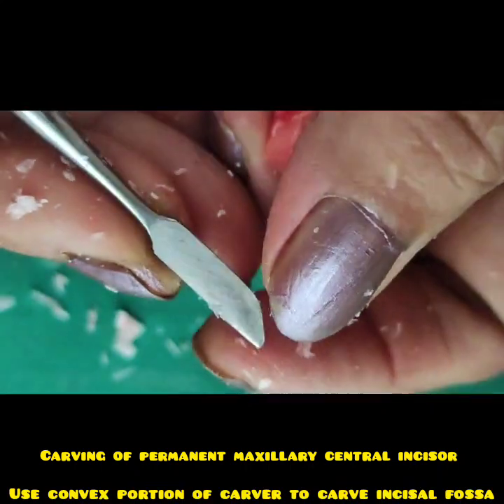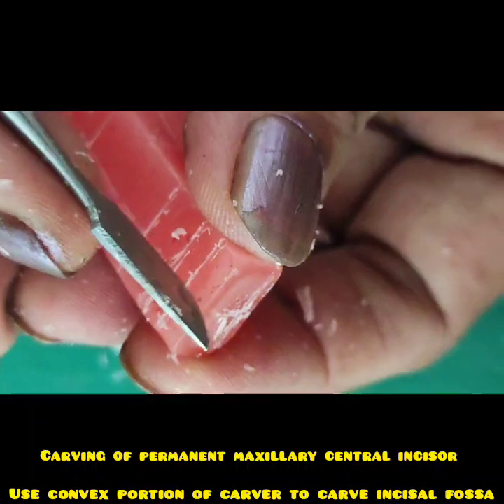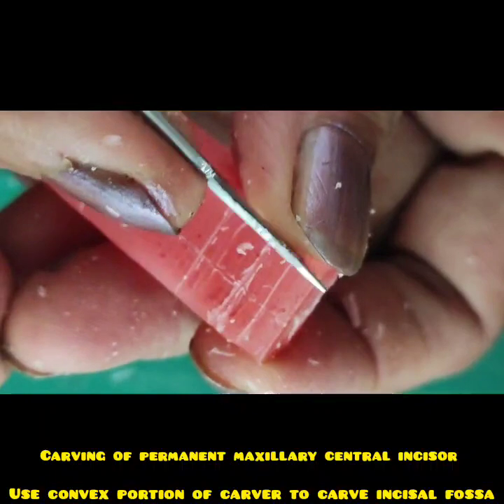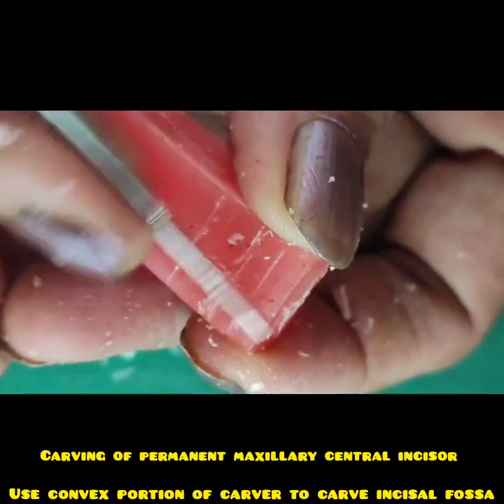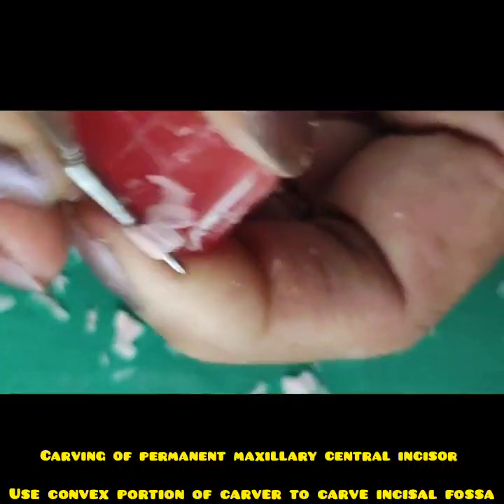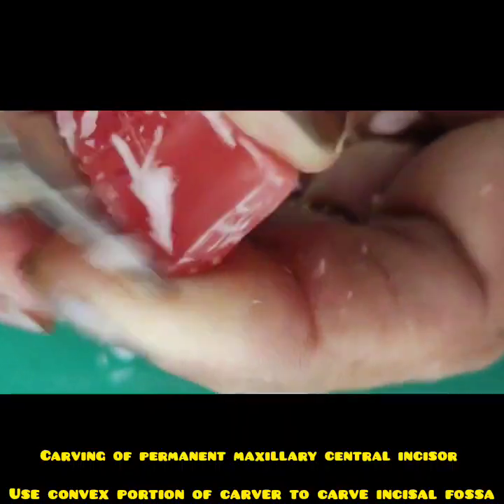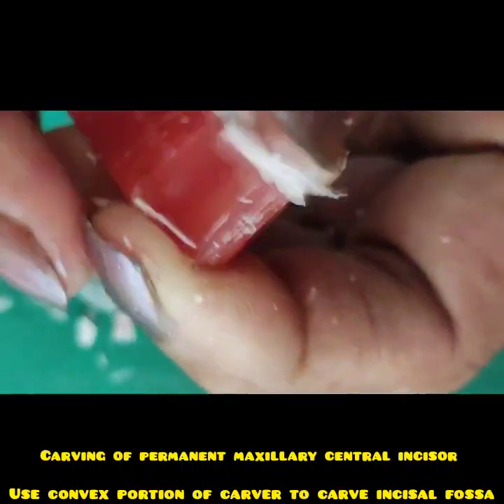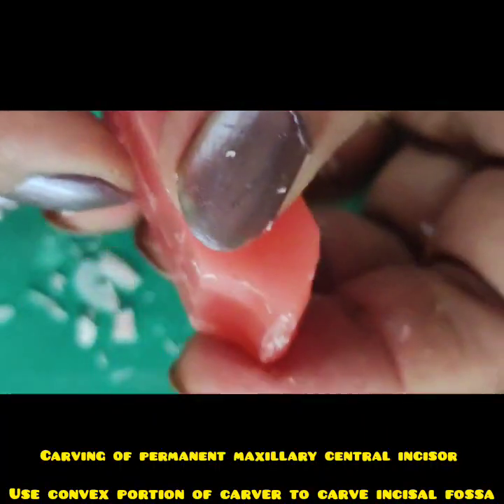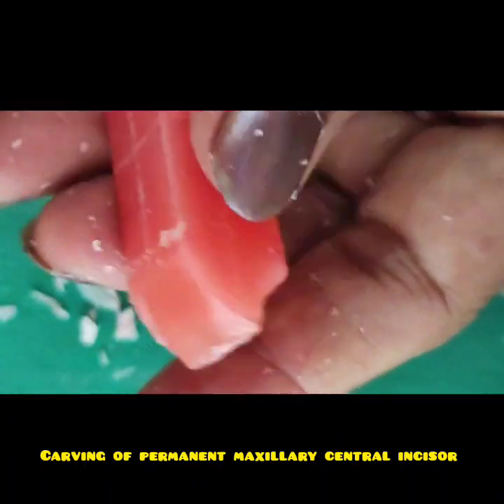Now use the convex portion of the carver to create the concavity of the fossa. This is lower 1/3, upper 2/3. My convexity will touch here, and then from thumb to index finger move horizontally and create a concavity. Very quickly you can do it like this. You can see I am creating a concavity and reducing towards the labial surface. This is how my labial and lingual are quickly done. These are the tricks.